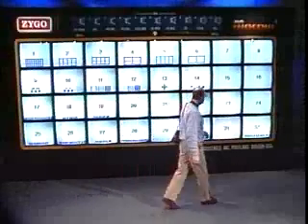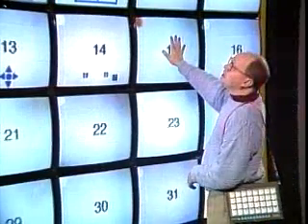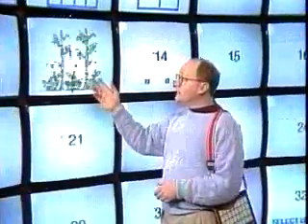Now it's easy. As a facilitator, or someone who programs the macaw for the user, I simply press the message key and say the desired message. "Can we take a walk?" To hear the message, the user presses the same message key again. "Can we take a walk?" The user can easily remember what is stored under a message key by attaching graphics to a plastic overlay.